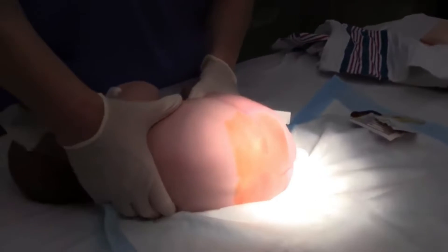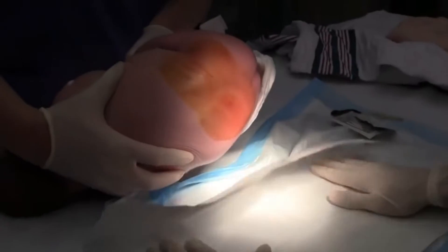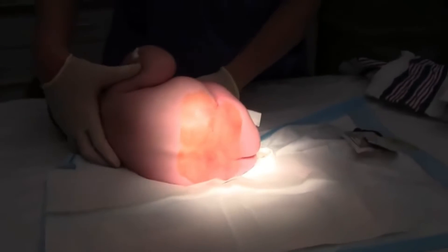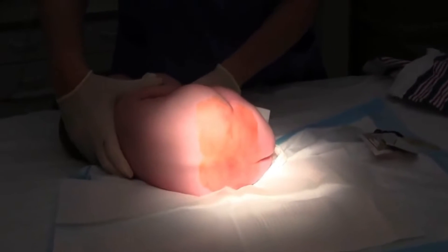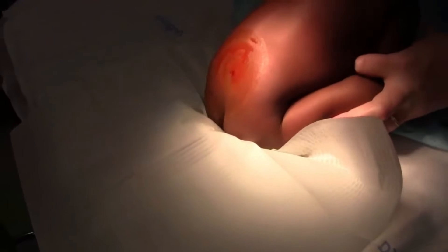The infant should be placed in a safe and comfortable position for the procedure. The lateral decubitus position is commonly used, where the baby lies on their side with their knees bent towards their chest. Another popular option is the upright position, which allows for better visualization of the landmarks, better infant oxygenation, and increases the success rate of the procedure.